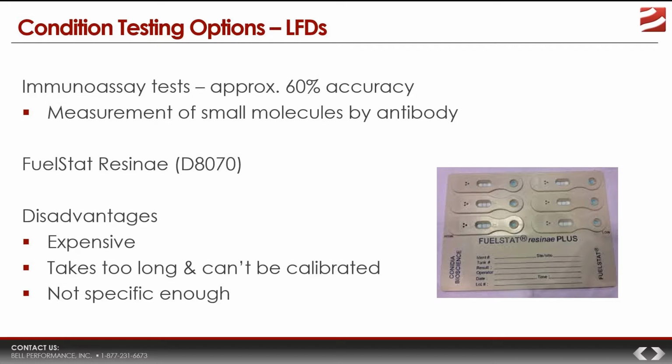Just as you ask of a culture test, how do I know if these are accurate? You have to store these LFD tests under controlled conditions. How do you know if you left it in your car for a certain amount of time, or in the technician's truck, and he does the test, that the test is still viable? There is no way to know for sure.